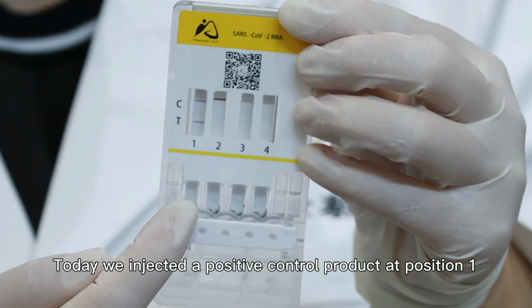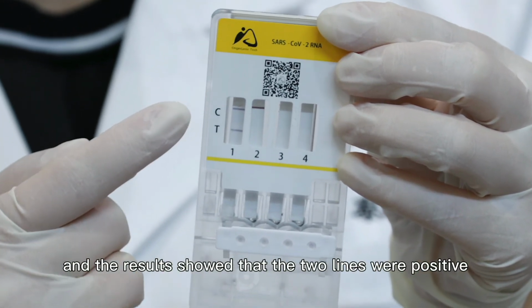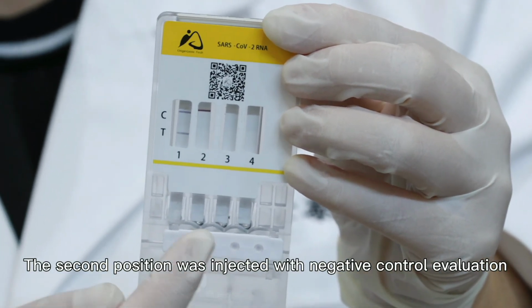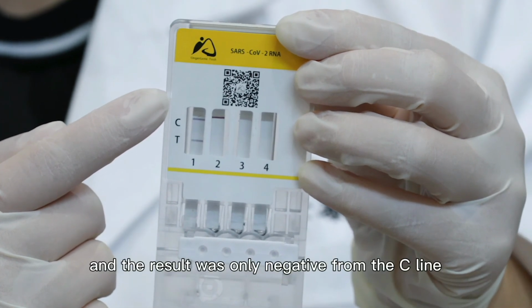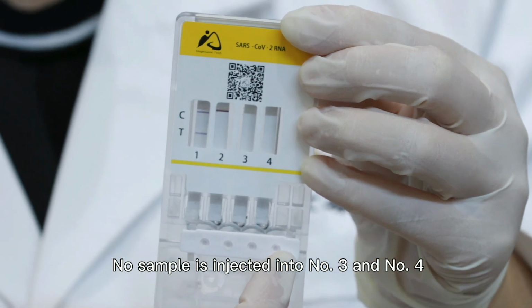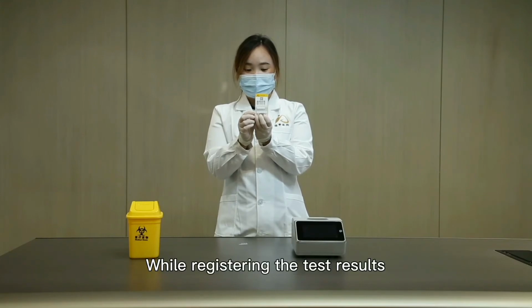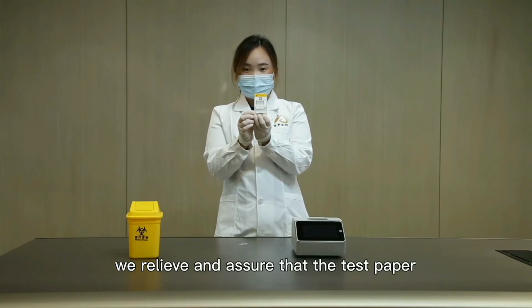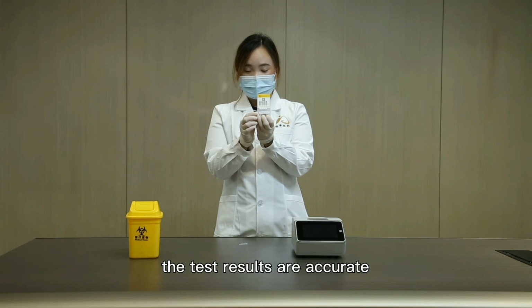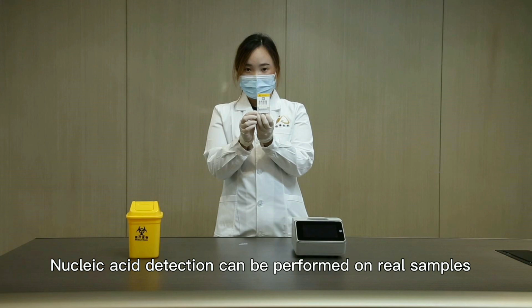Today, we injected a positive control product at position 1, and there were 2 lines colored. The result is positive. The second position was injected with negative control, and the C line was colored. No samples were injected into number 3 and number 4, and the test strips are also blank. While registering the test result, we can be assured that the test paper and the instrument are working normally. The test results are accurate. Nucleic acid detection can be performed on real samples.